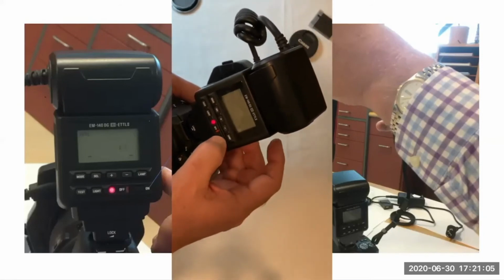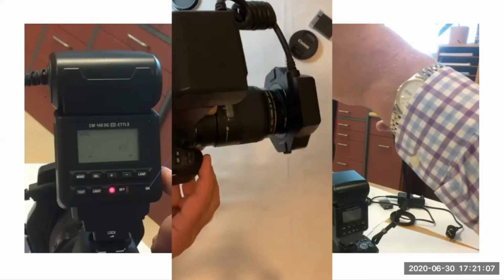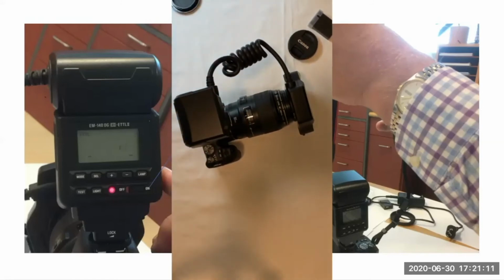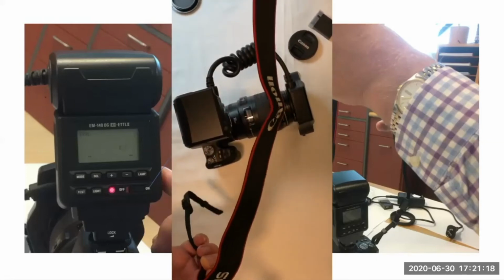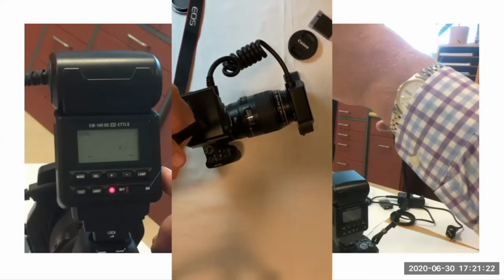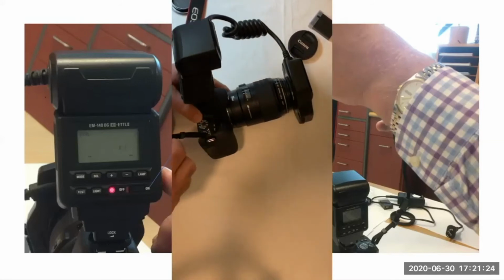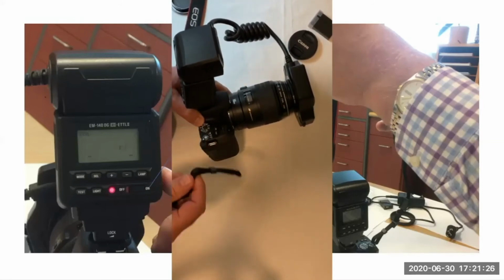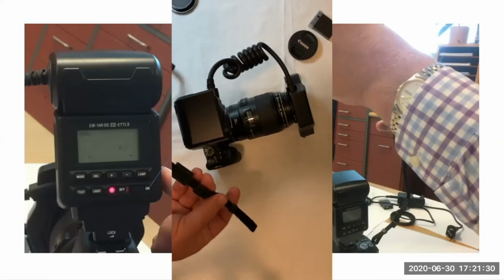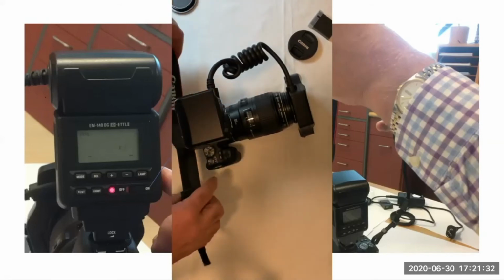Probably though, the most important thing when you're setting this up for your clinic is to make sure that it doesn't get dropped. So put this on. It's a little bit fiddly, but put it on through the little connectors that are on the side, so that anybody who's using it can hold it around their neck, and hopefully it'll survive.